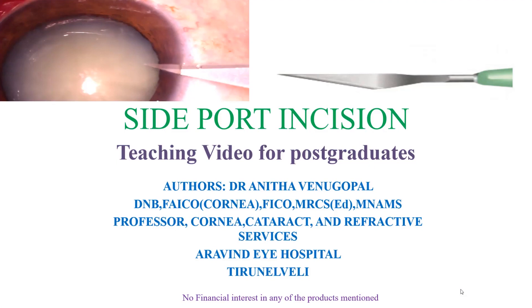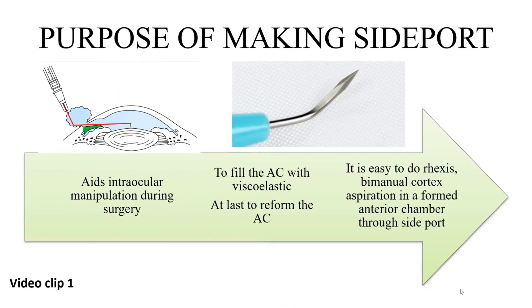The purpose of making a side port in manual small incision cataract surgery is to fill the anterior chamber with viscoelastics and to reform the anterior chamber. It aids in intraocular manipulation during cataract surgery, and it is easier to do capsulorhexis and bimanual cortex aspiration in the formed anterior chamber through the side port.